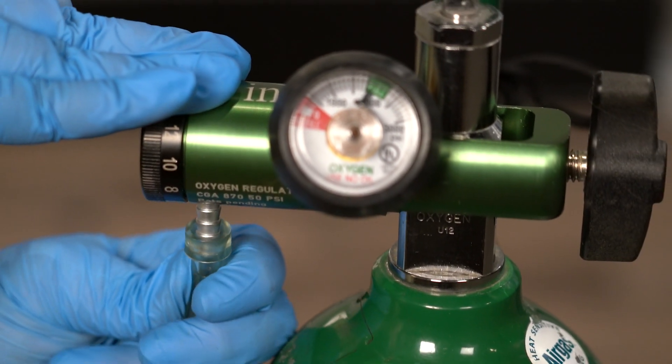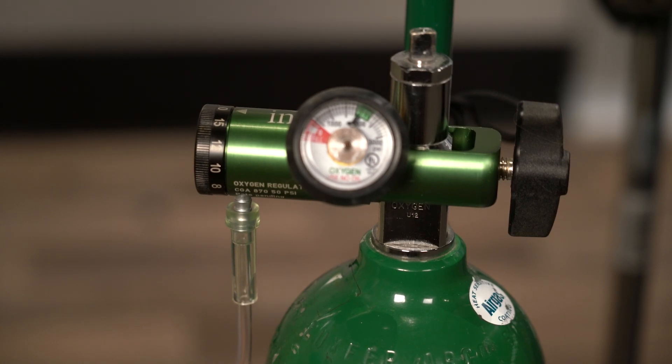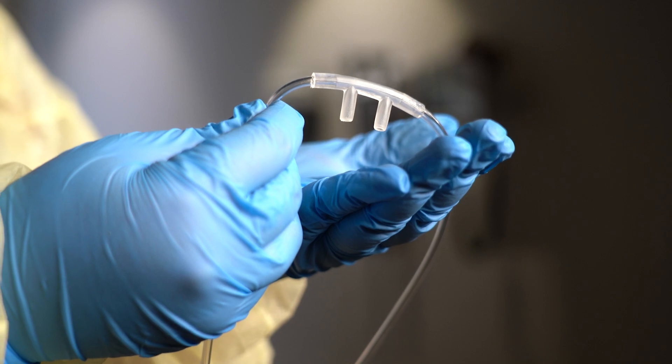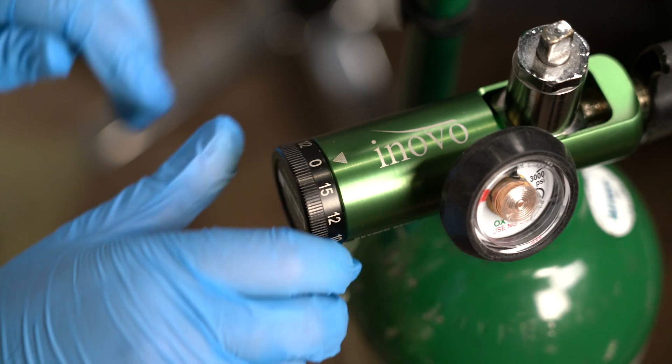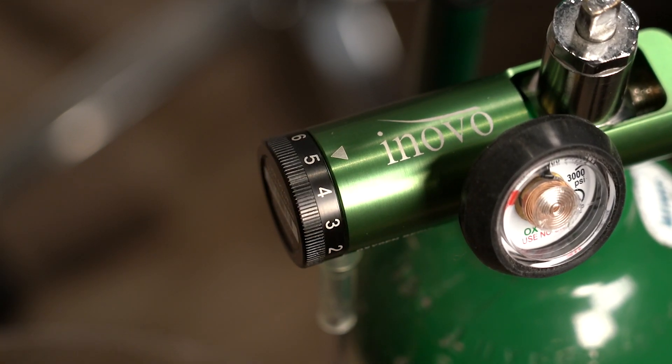Make sure that all the tubing is properly connected. If it's loose, tighten the connection. If you aren't sure whether the equipment is working, place your hand in front of the nasal cannula to feel if the oxygen is coming out. Since the patient is an adult, you can start the oxygen at 5 liters per minute.